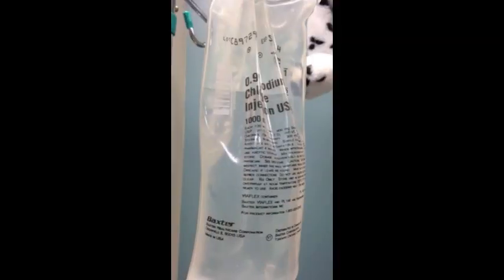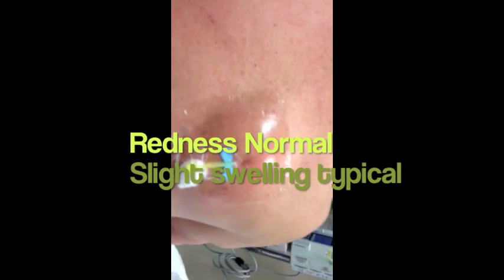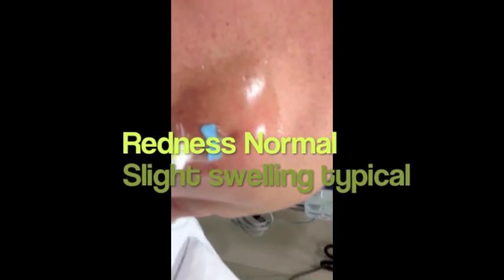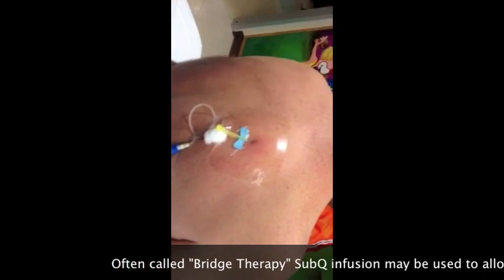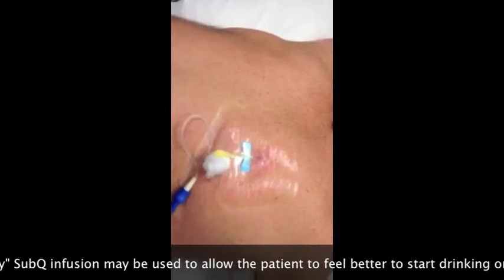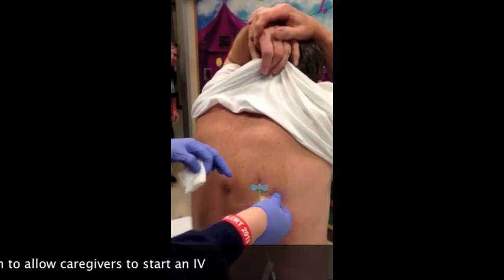That makes me anxious with a needle there, but it doesn't feel any different. Is it still going? Yes, it's still infusing — at an adult rate of 125 an hour. Don't feel a thing. At 20 per kilo, so we're doing 100. But it's awfully red right there.